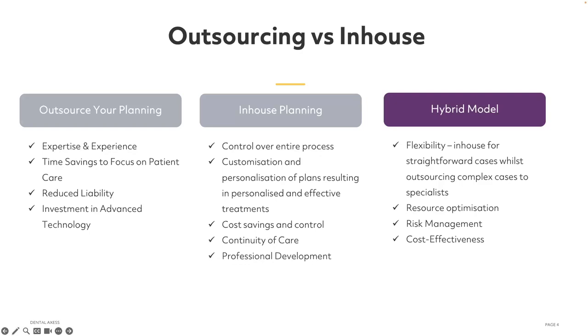In being able to choose between outsourcing and doing it yourself for clear aligners, it depends on the complexity of each case and the resources available to you. By integrating both of these approaches into a hybrid model, we can deliver optimal care and ensure the best outcomes for your patients and your customers.